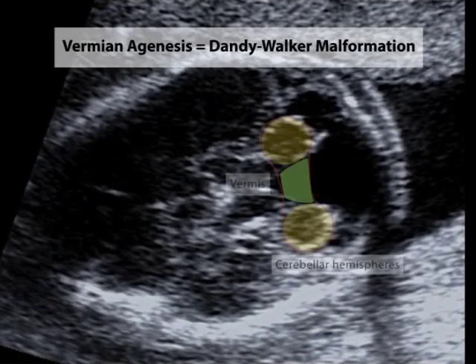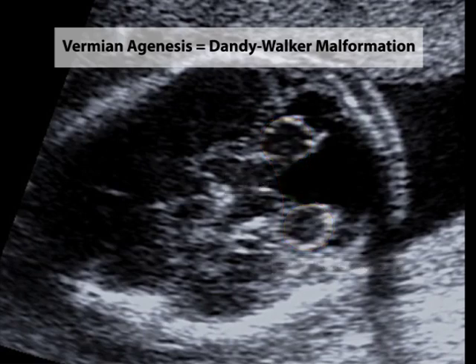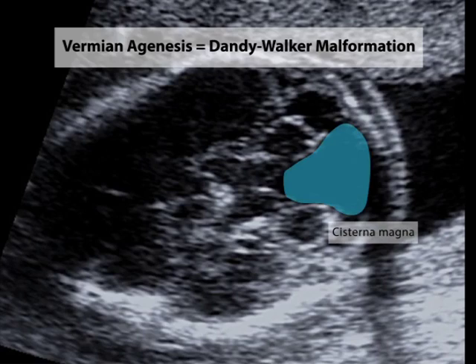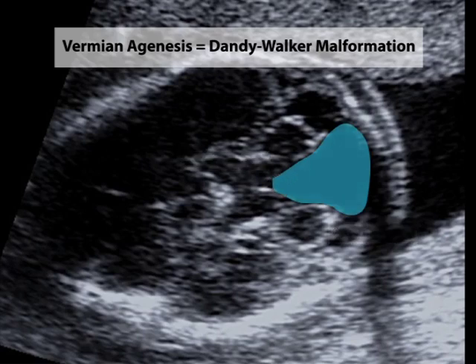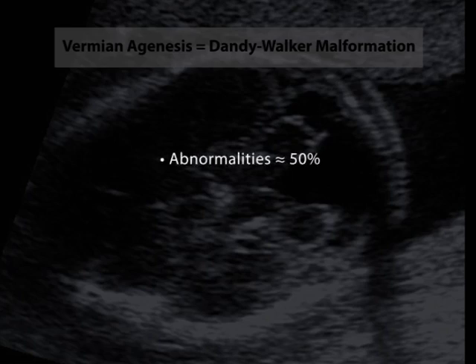Certain abnormalities involving the posterior fossa are identified in the transcerebellar view. The Dandy-Walker malformation is characterized by agenesis of the cerebellar vermis. Sonographically, the absence of the vermis and separation of the cerebellar hemispheres permits fluid in the enlarged cisterna magna to communicate with the 4th ventricle. Vermian agenesis is associated with other abnormalities in approximately 50% of cases and aneuploidy in 40%.